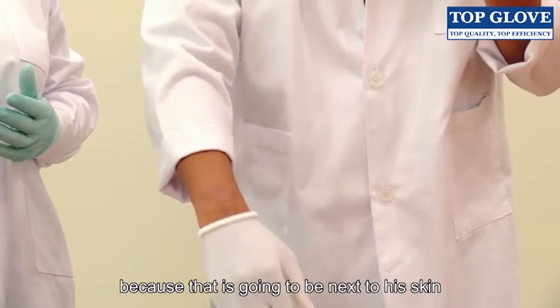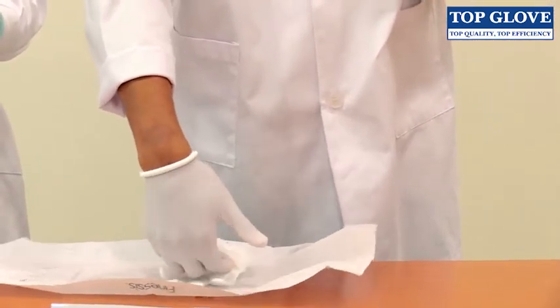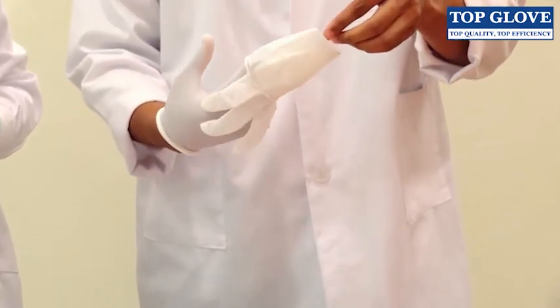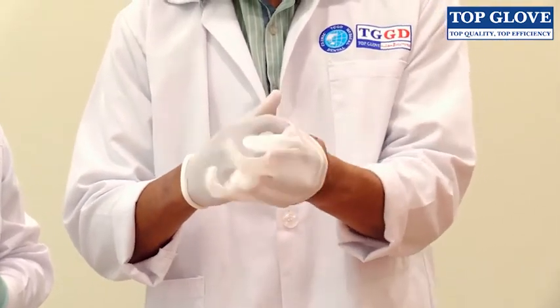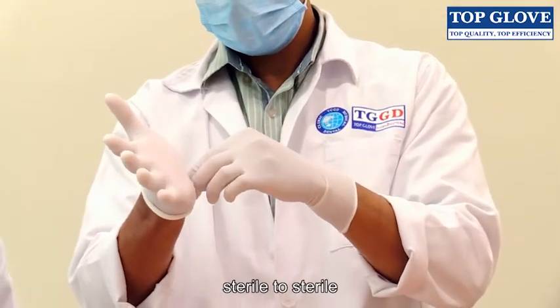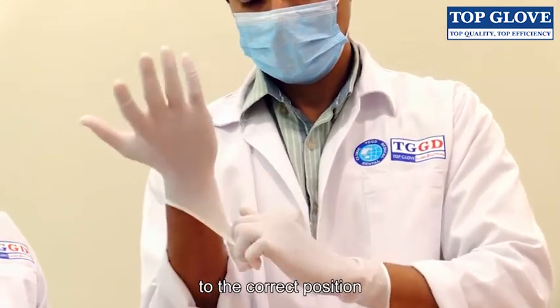The surgeon can grab the inside area because that's going to be next to his skin, and then touch the exterior of the glove to pull it on. Reaching over, sterile to sterile, and stretching the cuff to the correct position.